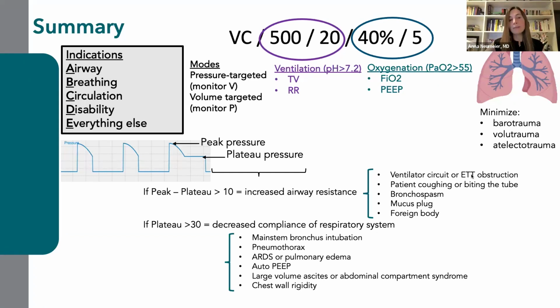And if you have high peak pressures with normal plateaus, that suggests an airways resistance issue. And if you have high plateaus, that suggests a reduction in the compliance of the respiratory system. And you should remember the differentials there.